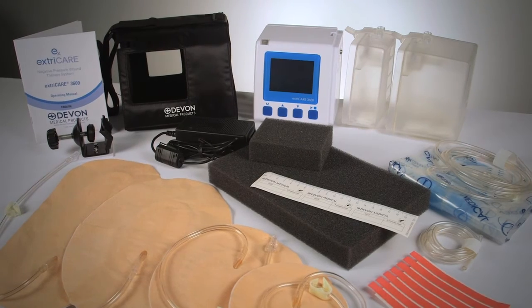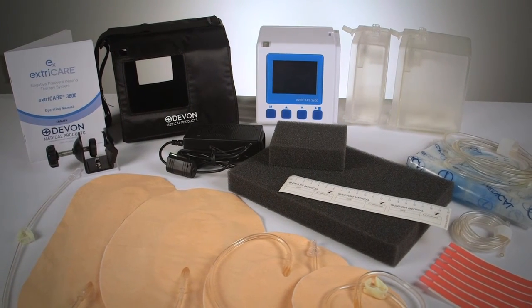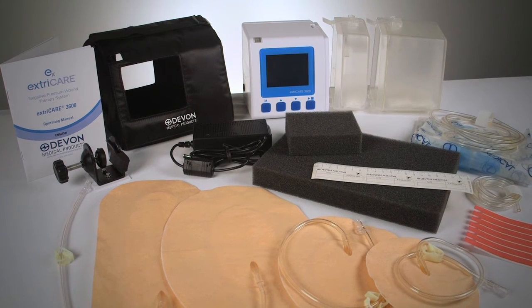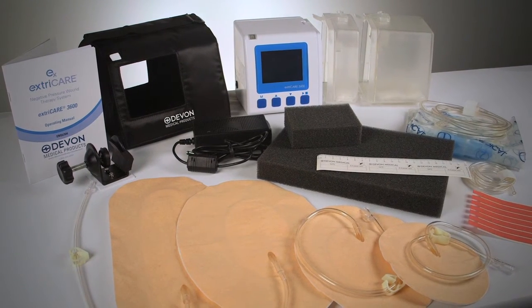Our ExtraCare 3600 system comes equipped with a power adapter, a rail clamp, a 400cc canister, and a user manual. Dressings, foam kits, additional and various sized canisters, carrying cases, and other accessories are sold separately.